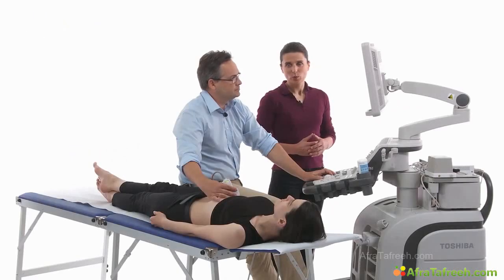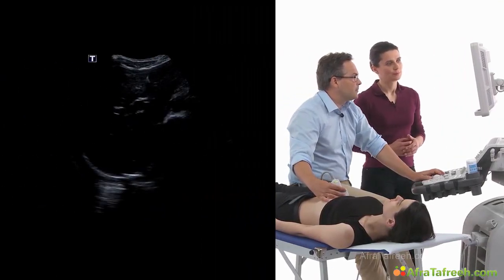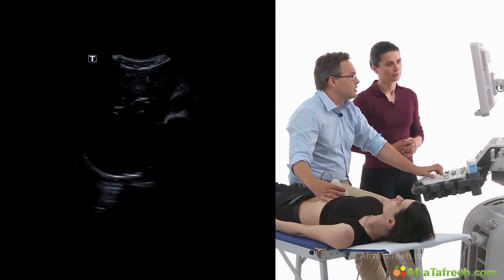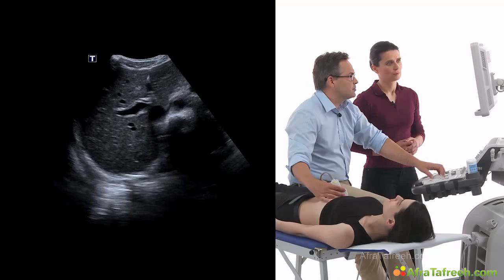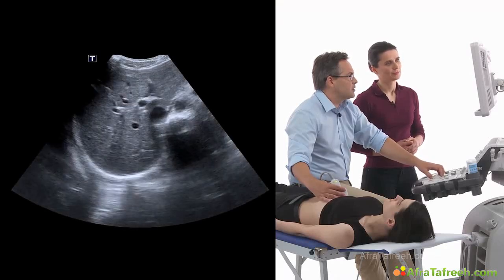The next adjustment we want to optimize is to have the right gain, the brightness of the picture. So over here, I think we cannot see anything because the gain is too low. I'm going to increase it, and the picture improves magically. But there's a point we have to stop.